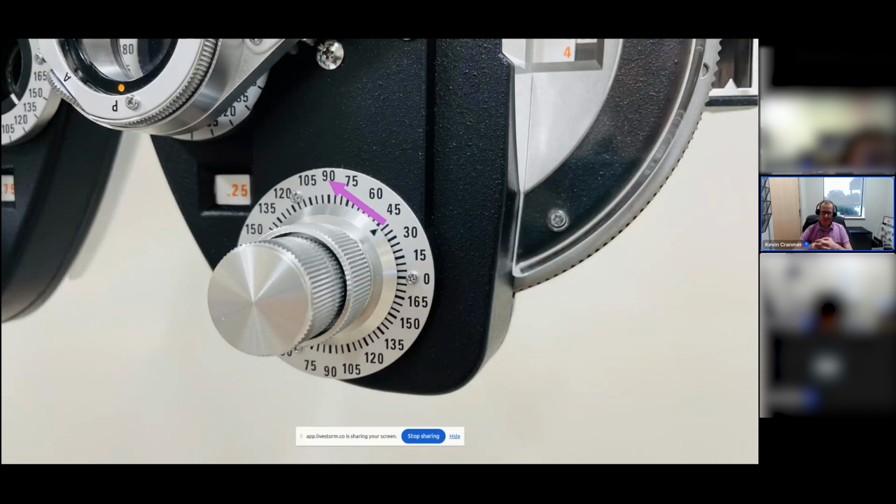And if it's more cylinder power, if it's 3/4 or more, you only really need to rotate it 2 of those little tick marks. Those tick marks are 5 degrees each, so you'd rotate it about 10 degrees, because usually you'll be pretty well lined up and you'll save yourself a little bit of work, because they're probably not going to be that much different. When the astigmatism is lower, it's harder for the patient to see, and it'll seem a little squishier, where the patient won't be quite as clear on where the astigmatism is, because there's not much astigmatism. So then you'd want to rotate it probably 4 of those tick marks or 20 degrees. And again, it doesn't matter too much.